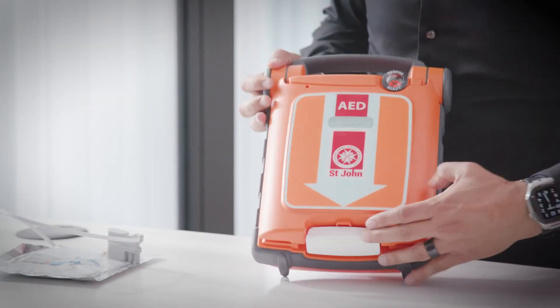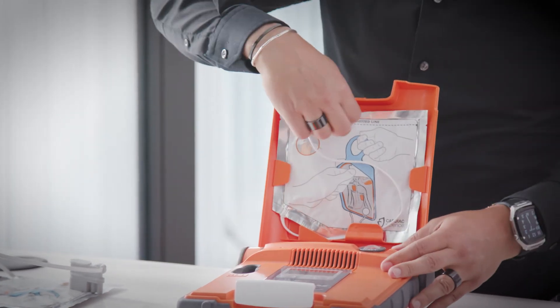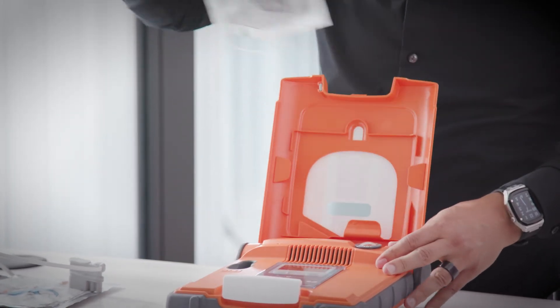To change over your St John G5 electrodes, open the lid of the device. Unplug and take out the old electrodes from the lid of the AED.